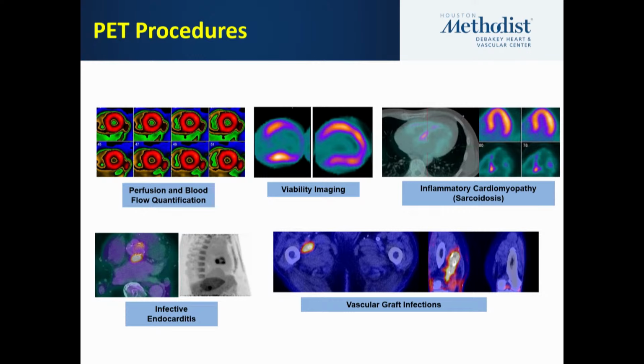In Europe, they do, for example, a lot of infective endocarditis imaging. In fact, I know some labs that have just one PET scan that does only infection imaging, like in some of these referral centers. So this is a modality that is underutilized in the US, and now it's one of those indications. I know we'll cover these more in the upcoming years, so you guys have a lot of dedicated lectures about these, but I'm just going to touch base on a few things.